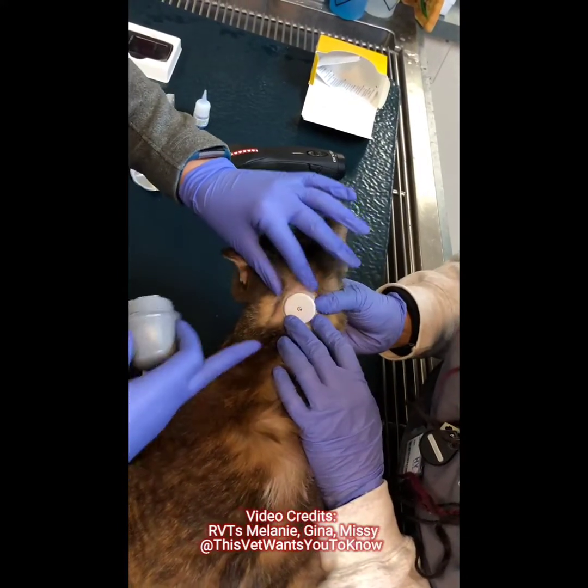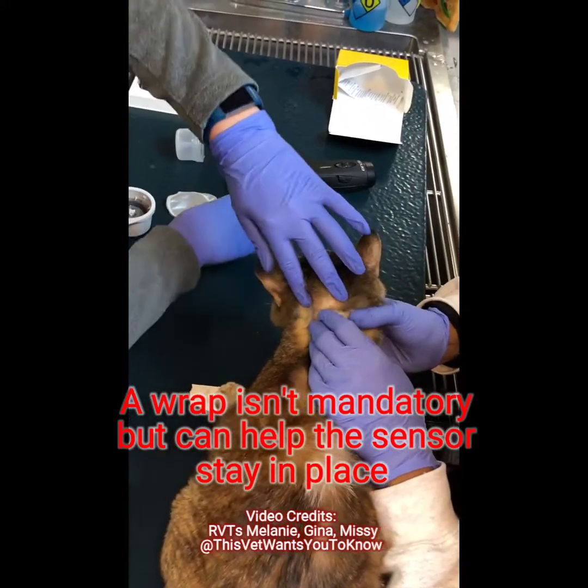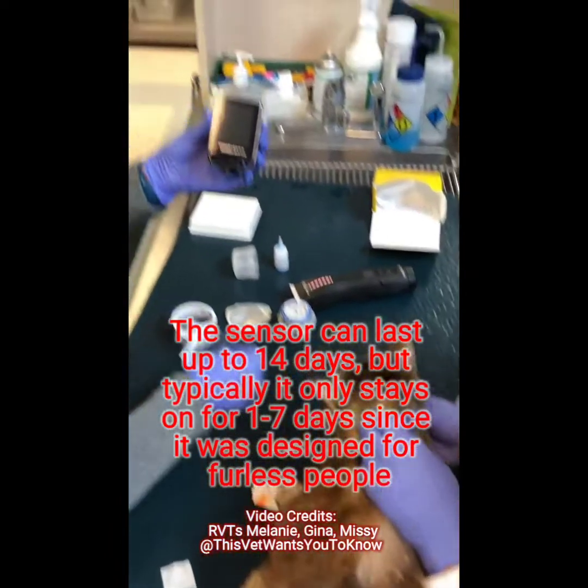And that's it — it's been placed. I'm going to put a little wrap on it to help it stay a little bit longer. Once you place it, you're just going to turn your reader on.